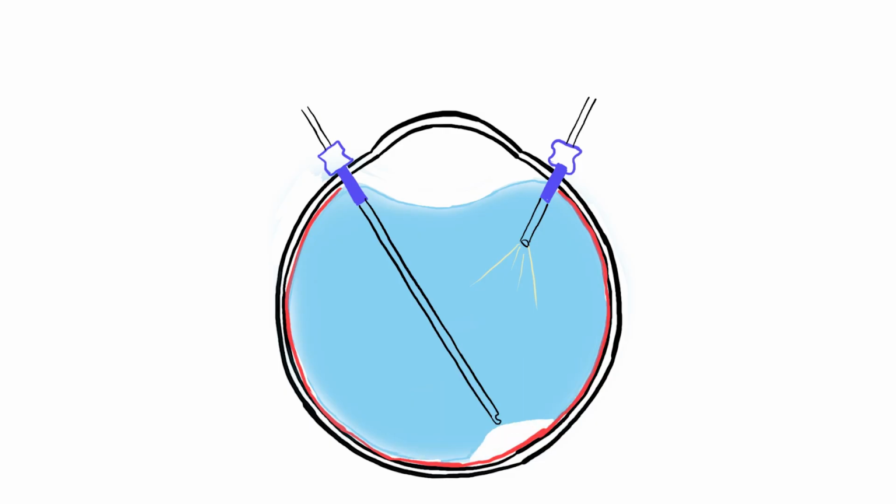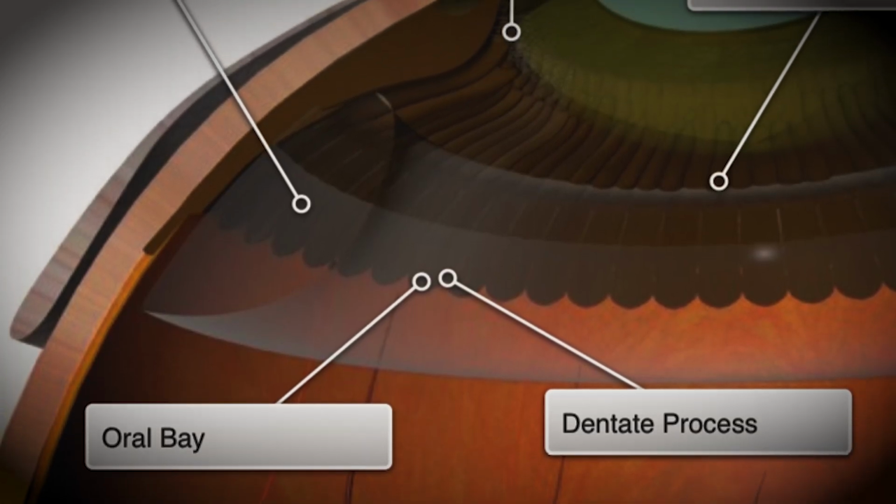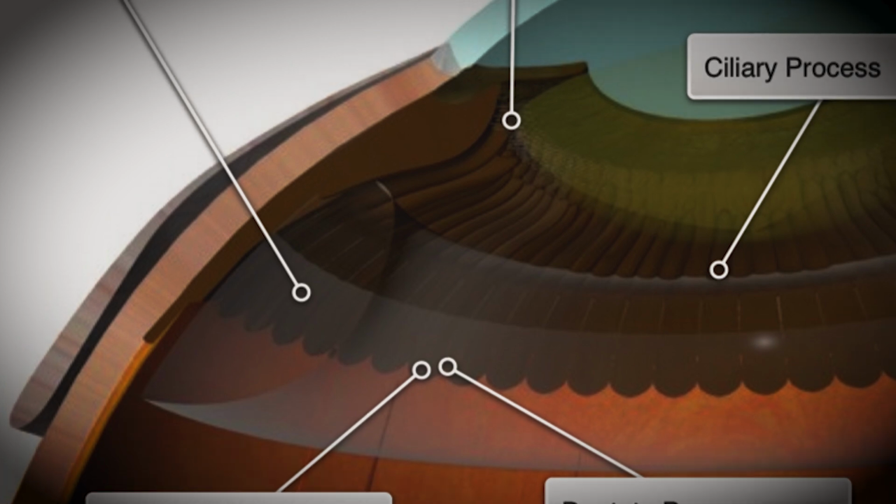Successful induction of posterior vitreous detachment or PVD is crucial for macular hole surgery. The PVD must be induced beyond the equator up to the ora serrata. While a pre-existing PVD is occasionally present, PVD induction is typically necessary in most macular hole surgeries.